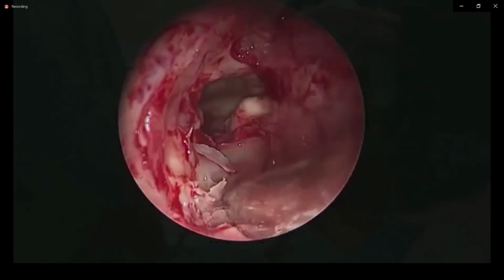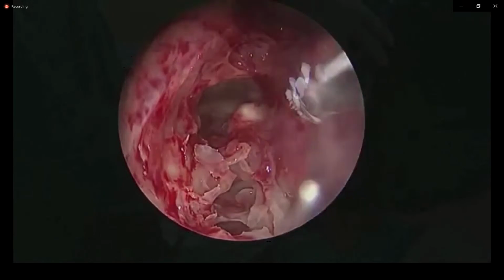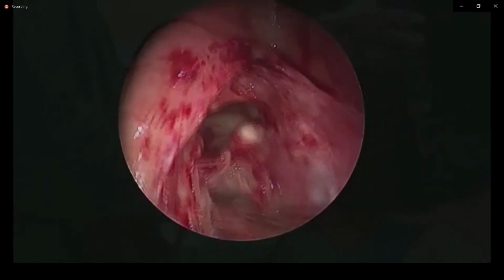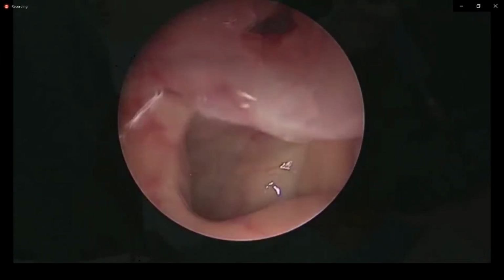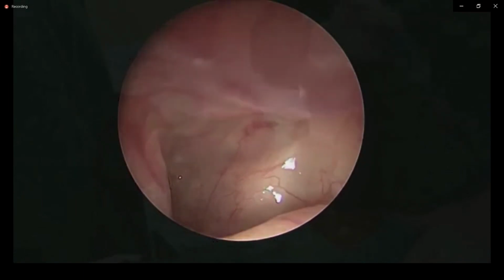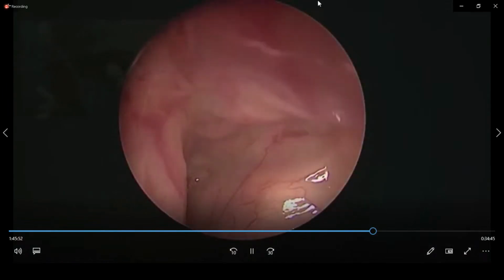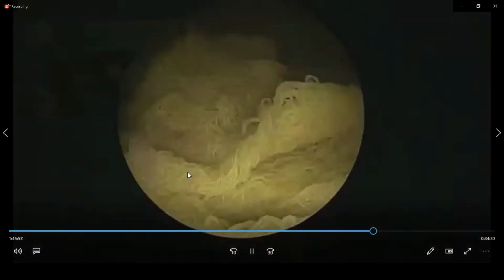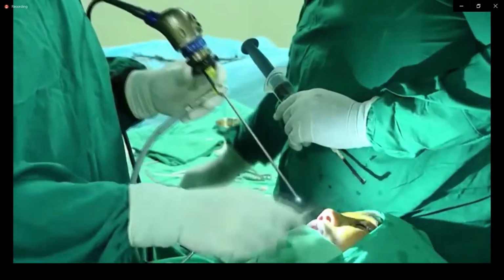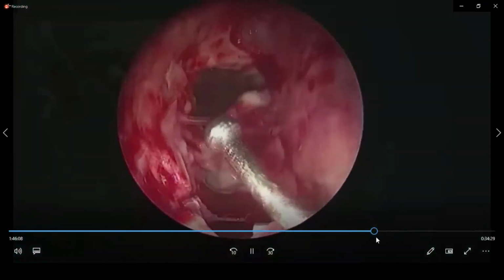See now, these are the cells along the skull base. The skull base is deeper, and we are opening all these cells with reverse blade to open up the skull base. See this? All these cells getting opened, and this is your supraorbital cell. Can you see very clear now? Yeah. And see the party wall. That's the party wall between the frontal sinus and supraorbital cell. If I remove this party wall completely, my frontal sinus outflow will be much, much bigger, and the supraorbital cell will join the frontal sinus to give a wide opening.